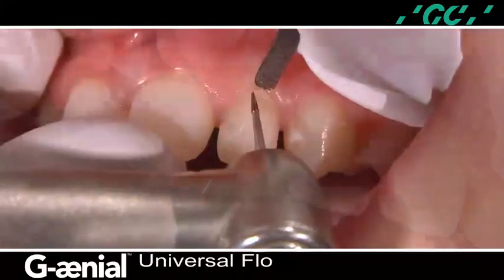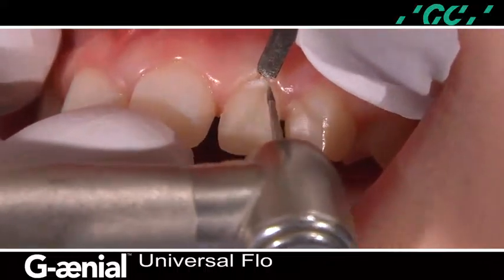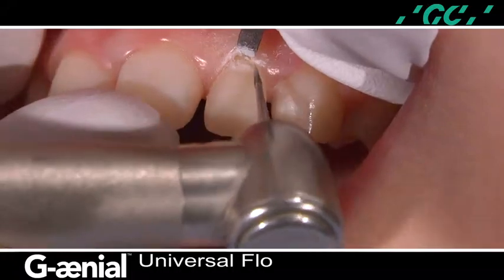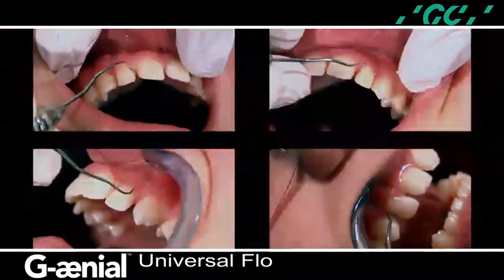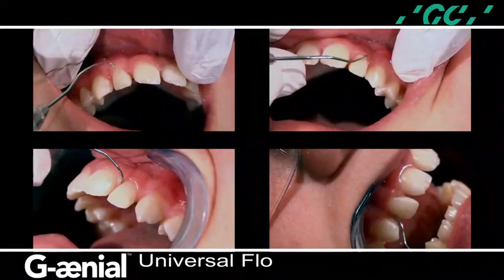It is important to use a dry protocol to visualize the tooth structure and the gingival margin area. An ideal contour and surface finish maintains the biological balance at the gingival interface. Notice the optimal emergence profile that was developed in the initial wax-up and the marginal integrity at the interface.